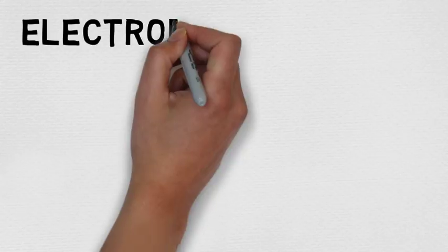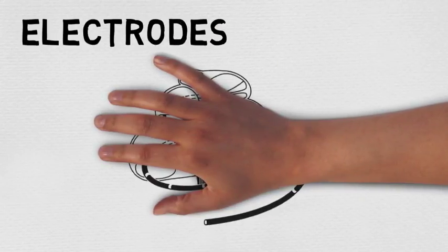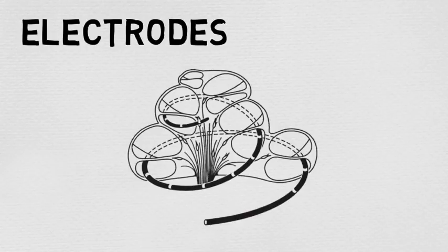To avoid electrode interaction caused by electrical field overlap in stimulation, which can smear the band spectra, the envelope from each subband is amplitude modulated to a high rate, 800 Hz, pulsatile carrier that interleaves with the pulsatile carriers from the other subbands. In other words, only one electrode is being stimulated at any given time.